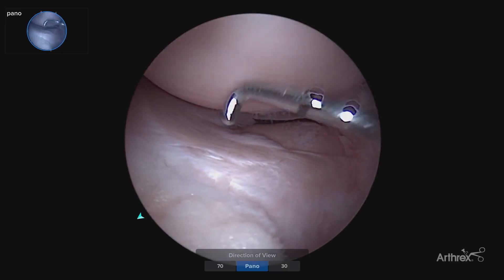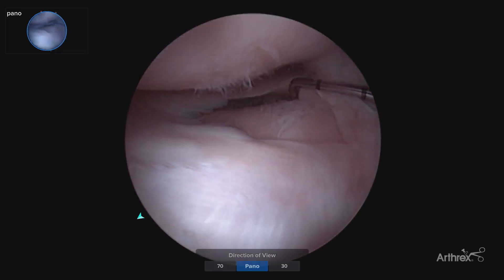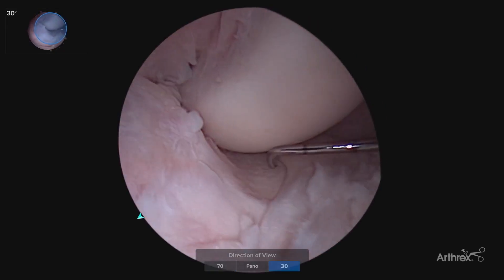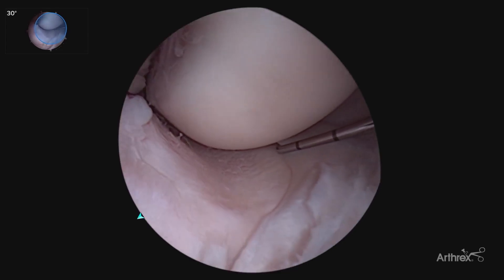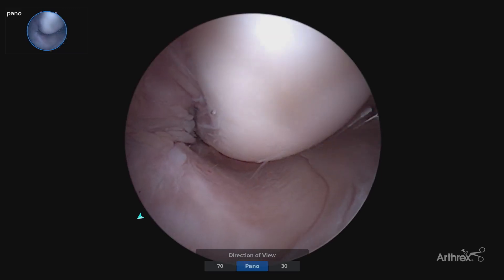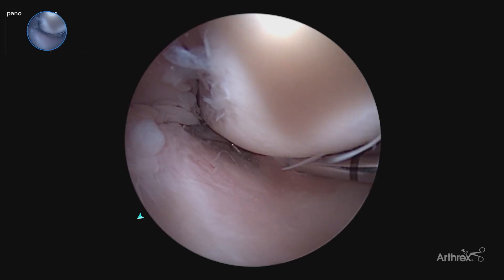Getting that much more global view of the articular cartilage surfaces, and global view of the meniscus. Coming over to our medial compartment, able to visualize with our standard 30 degree scope, and without having to change. Moving to that pano view, assessing the entire articular cartilage surface, as well as being able to see back towards the root.